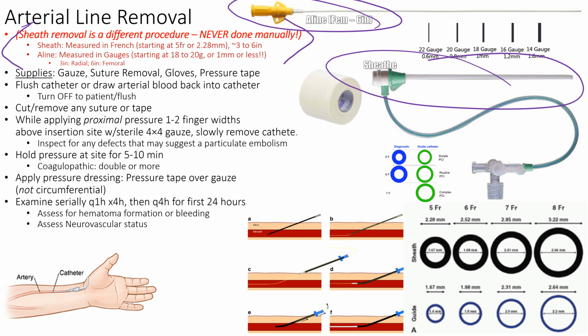Nowadays, we have this device here, so you can pass it around. This femstop is used to apply good pressure, and we can see the site the whole time to see if it's oozing or developing a hematoma. So it's a safer device. It's recommended, right? And then what else?